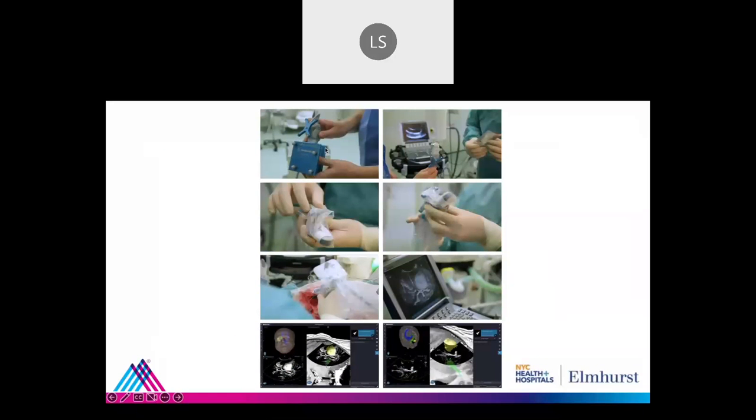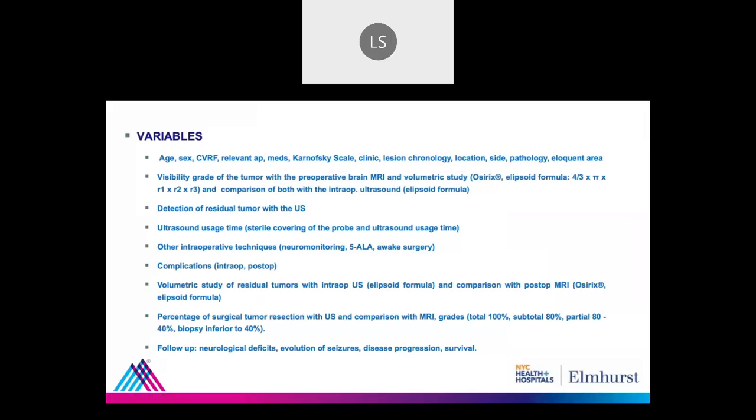We use the optical system, and what we did there is we put the conduction gel in a sterile fashion, and then we cover the ultrasound probe and the stel with a sterile cover. And this is the screen of the ultrasound itself, and this is the screen of the navigation system, where you can see the pre-op MRI fused with the ultrasound. And we study a lot of different variables.